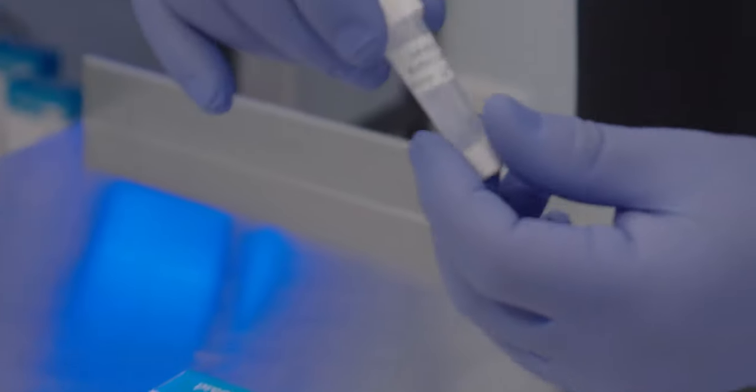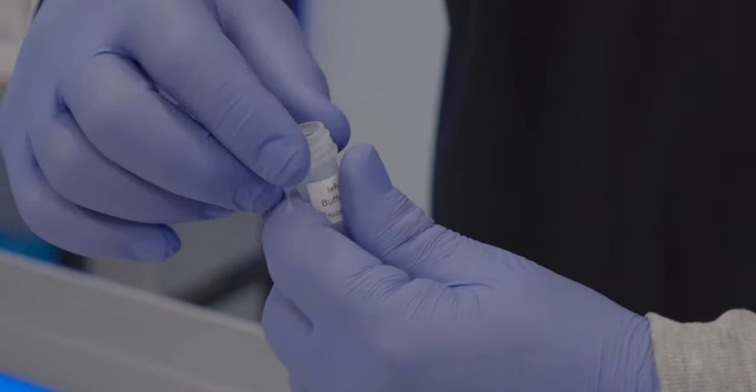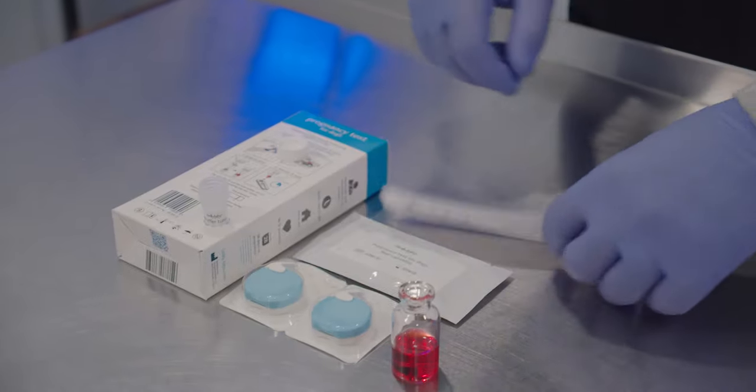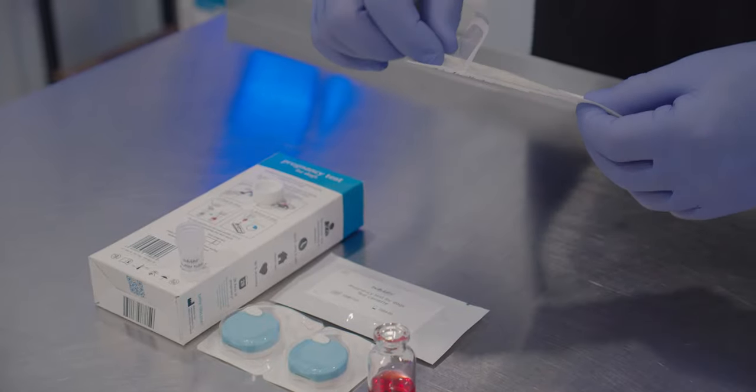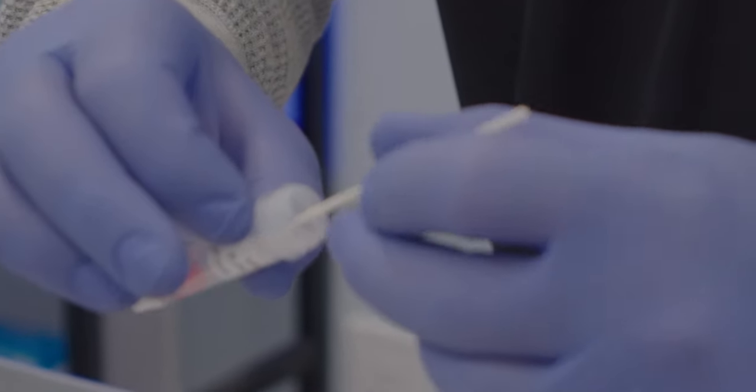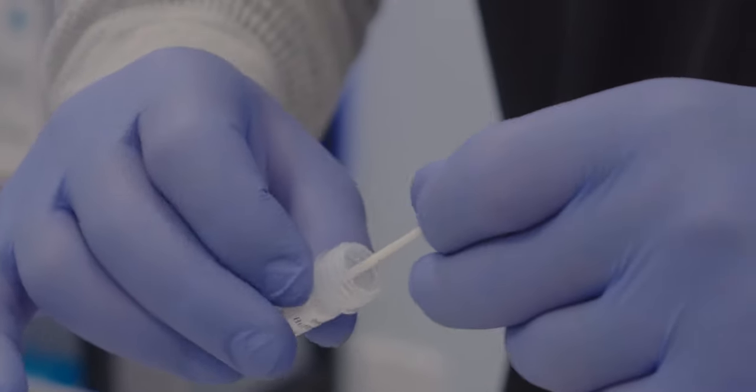After you've collected your sample, take the cotton swab and insert it into the buffer tube. Make sure to spin three to five times around the buffer tube and finally break the cotton swab off and close the cap back on the buffer tube.